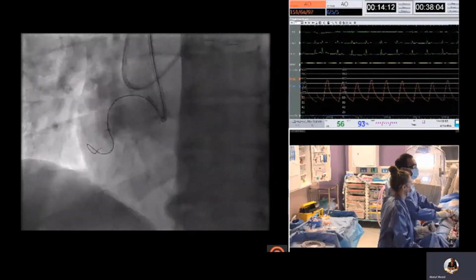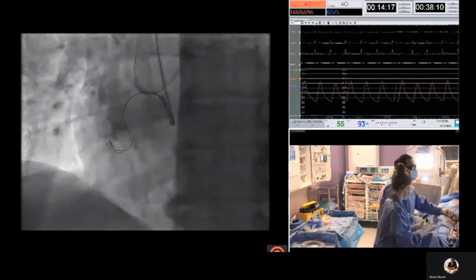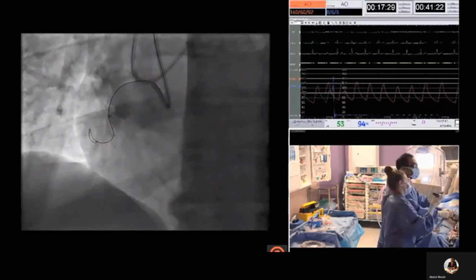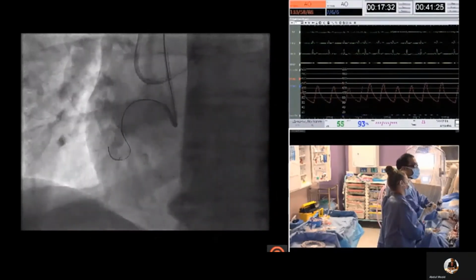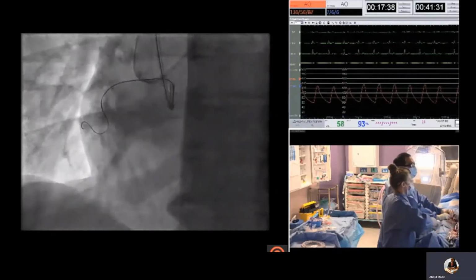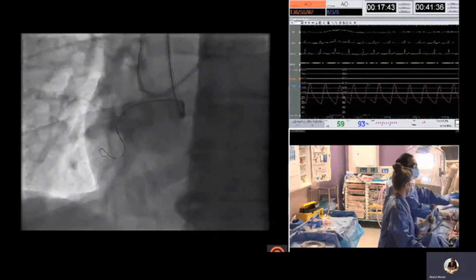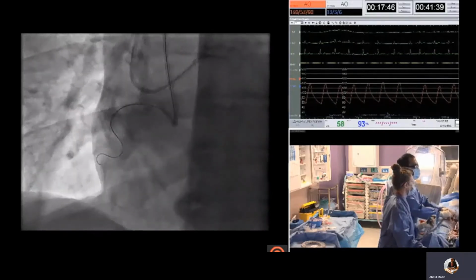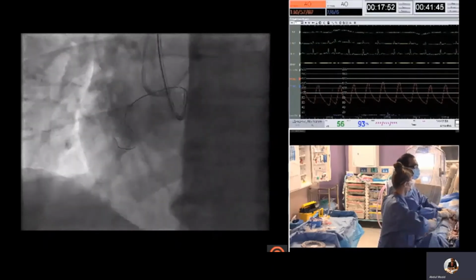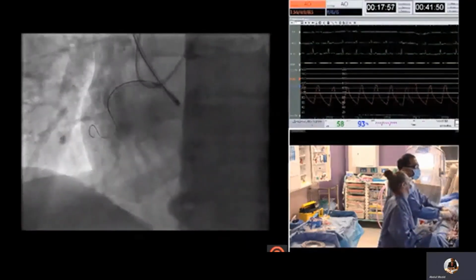deliver the Trapliner. So that's delivered nicely as far as the calcified occlusion. And again, despite having the Trapliner introduced quite far, it is impossible to pass any balloon through the calcified point. This is an Ikazuchi 1mm balloon and it still makes very little progress and leaves everything backing out. So clearly it was not possible to dilate this tract.